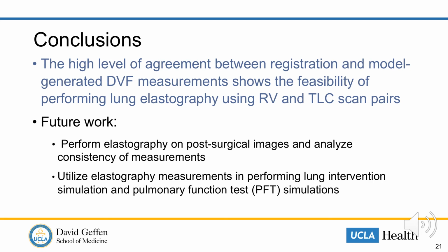Future work will include performing the elastography process on post-surgical images and analyzing the consistency of measurements in the contralateral lung and potential changes observed in the ipsilateral. Additionally, these elastography measurements are necessary to inform biomechanical model-based simulations of surgical interventions and pulmonary function tests that we hope will serve as a tool for patient selection.